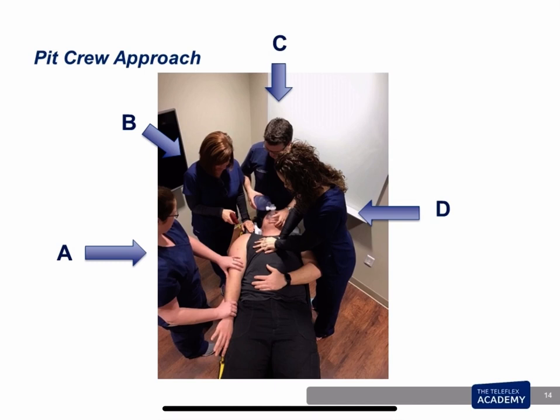There's usually one person managing the airway. There's one person on the side of the bed doing chest compressions, and the person on the other side of the bed typically is looking for an IV, but one can argue that it might be faster to just go up to the head and landmark and insert a proximal humeral IO. So this is an argument we hear, but I do feel that it's not with much merit.